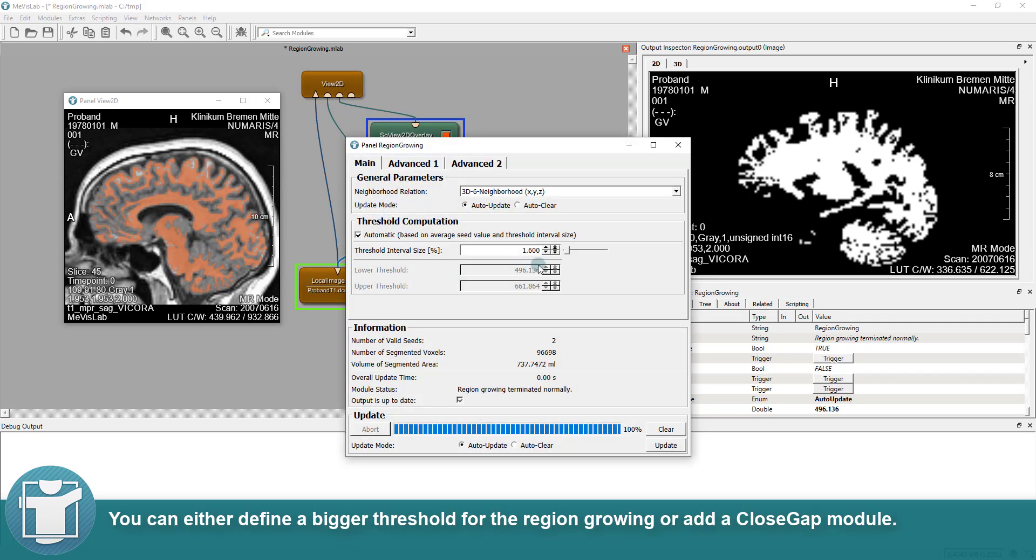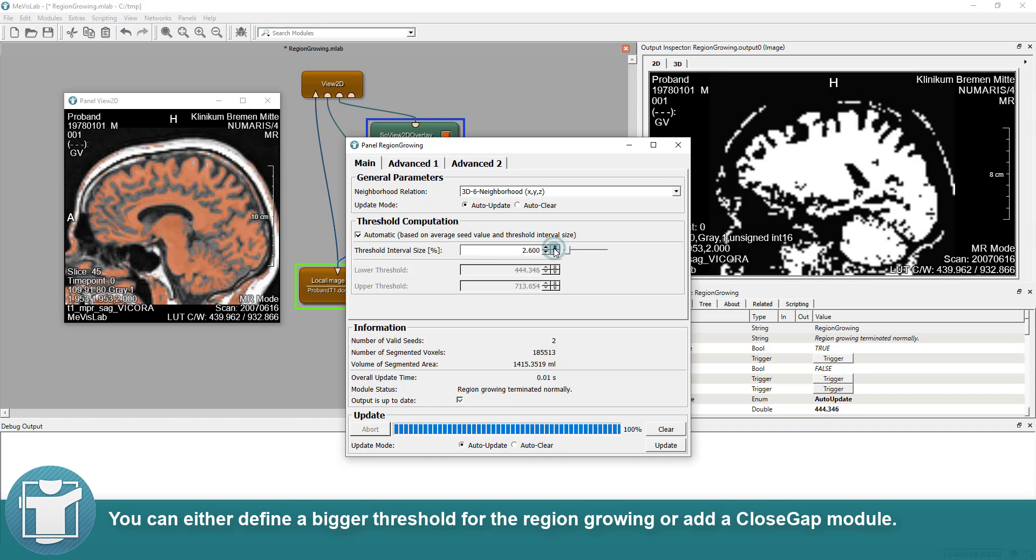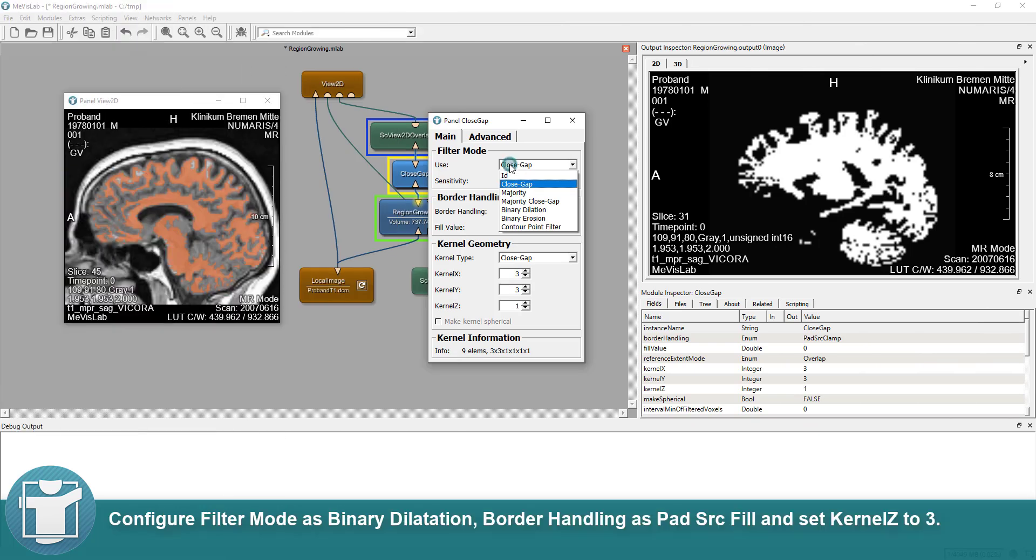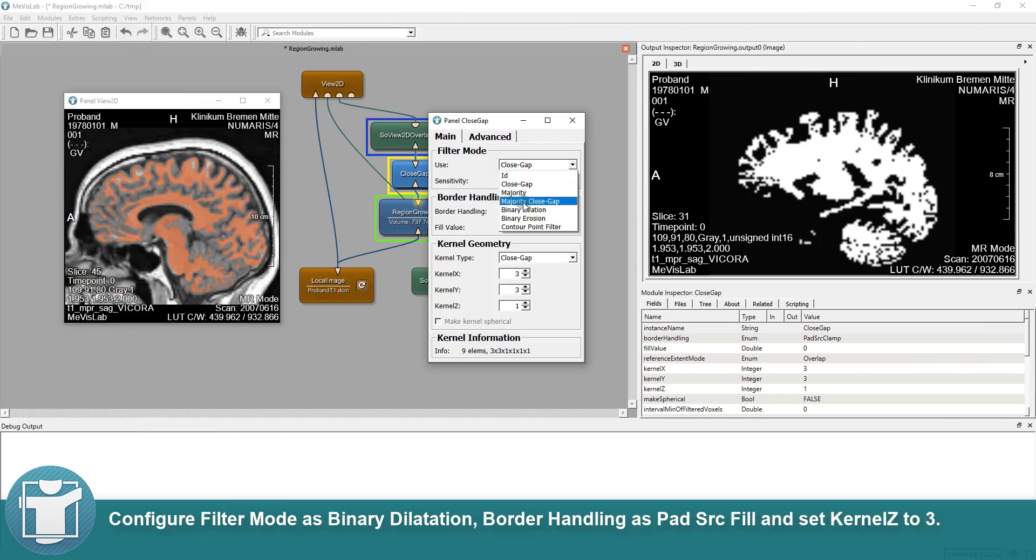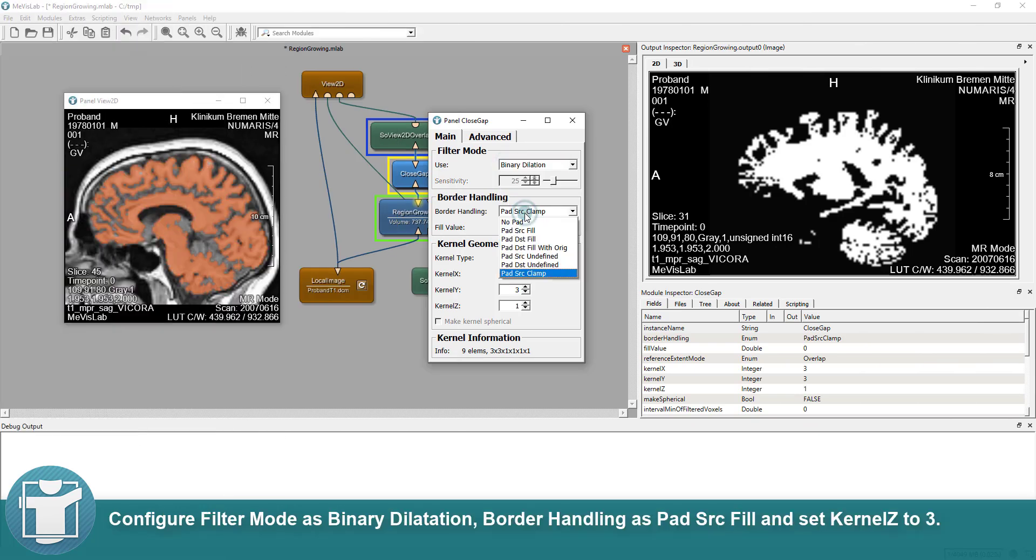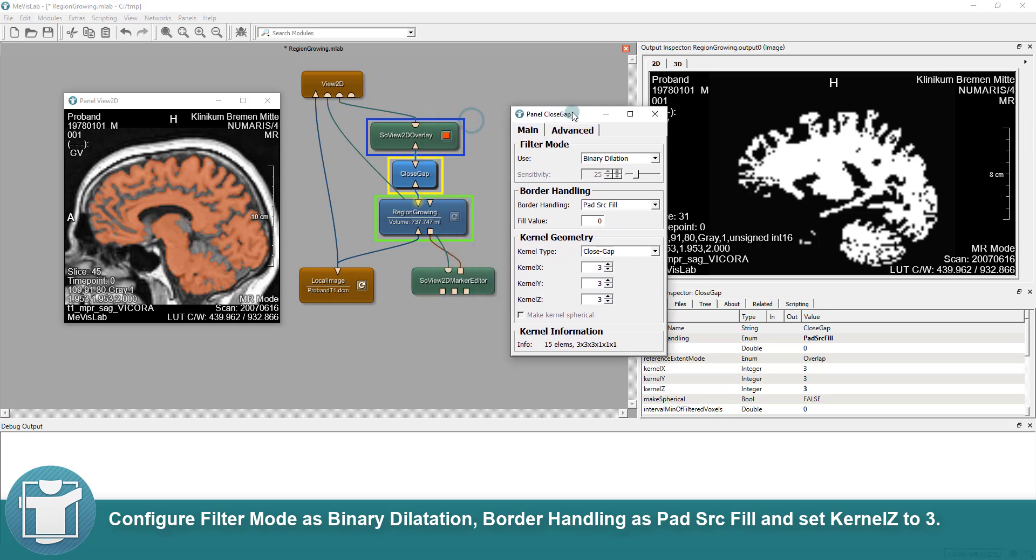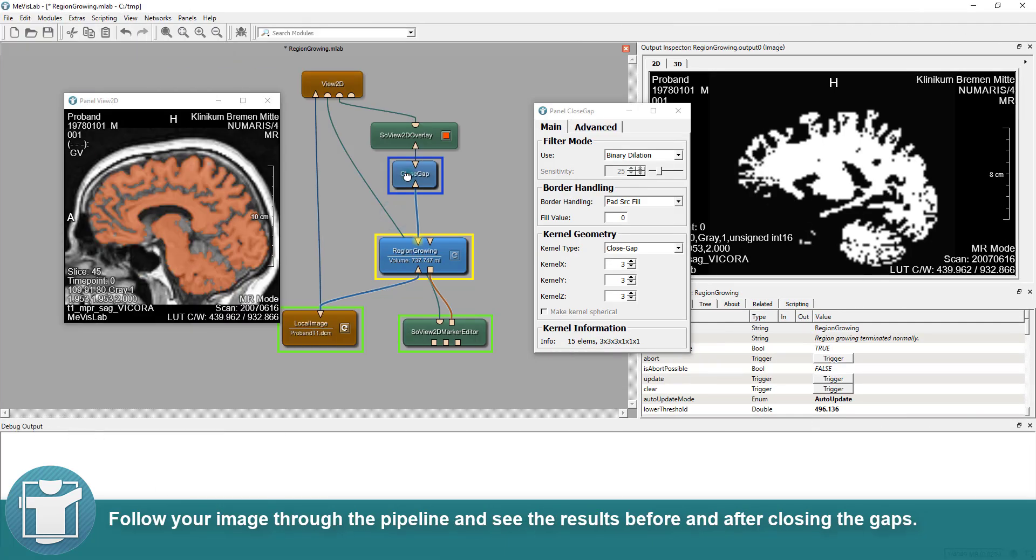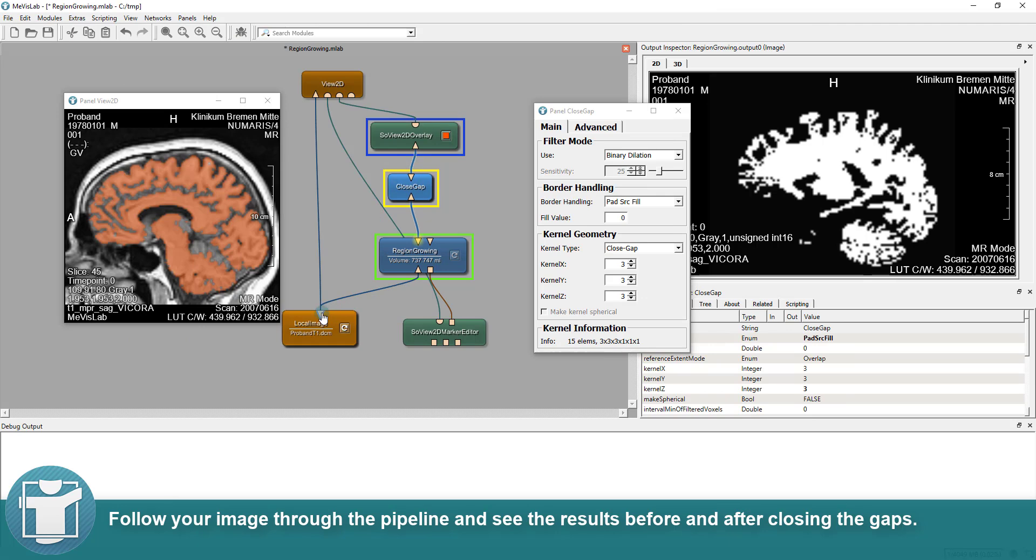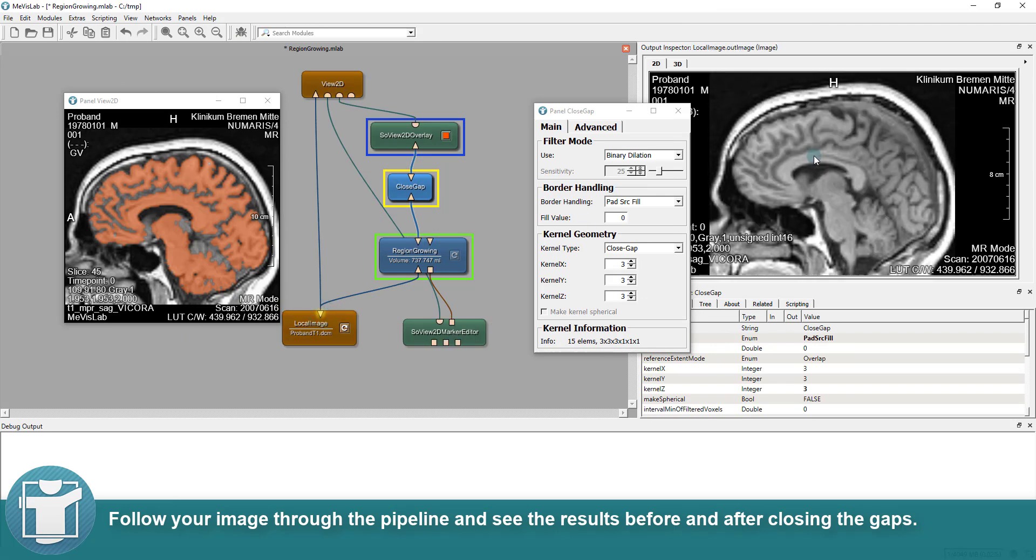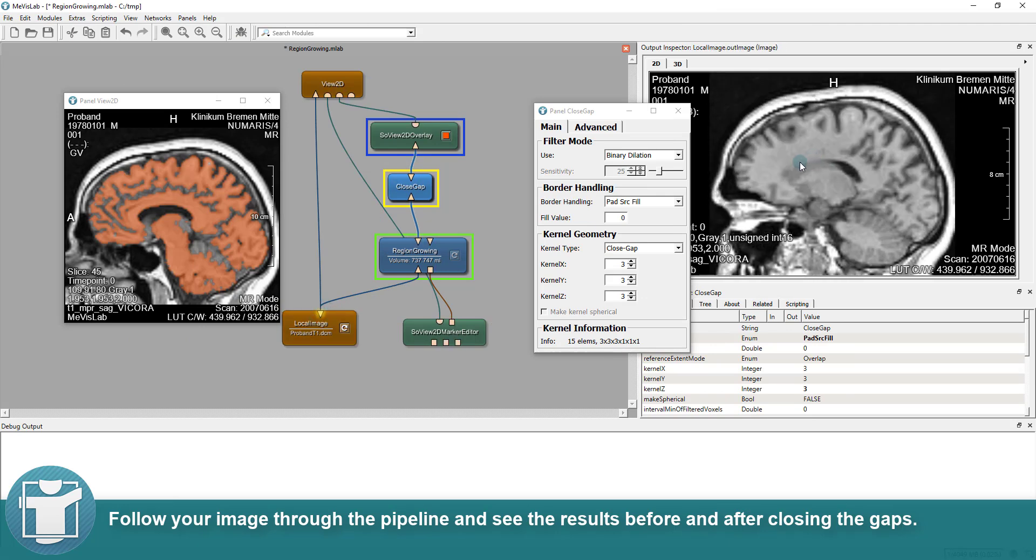You can either define a bigger threshold for the region-growing or add a close-gap module. We will add a close-gap module. Configure filter mode as binary dilatation, border handling as pad source fill and set kernel Z to 3. Follow your image through the pipeline and see the results before and after closing the gaps.